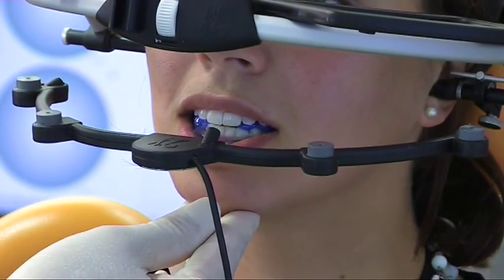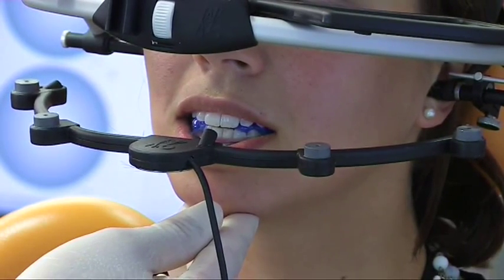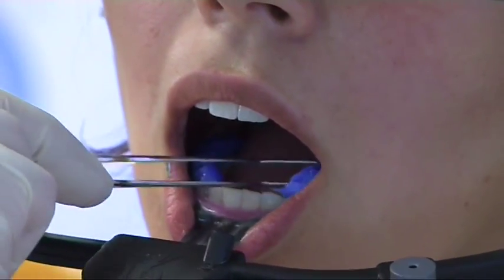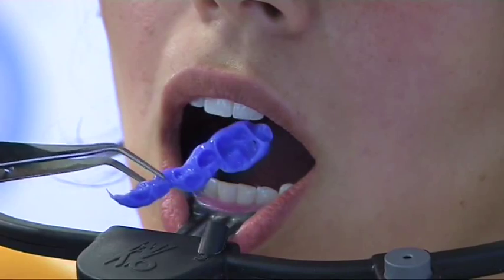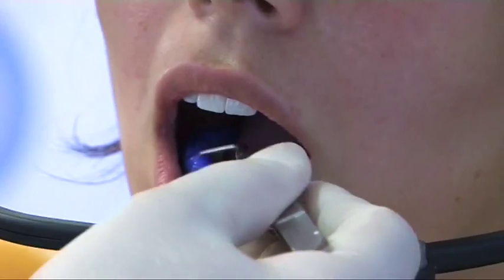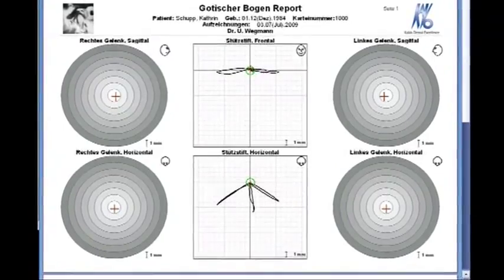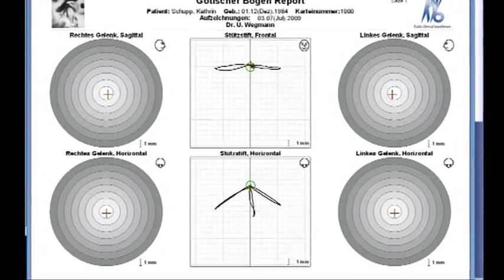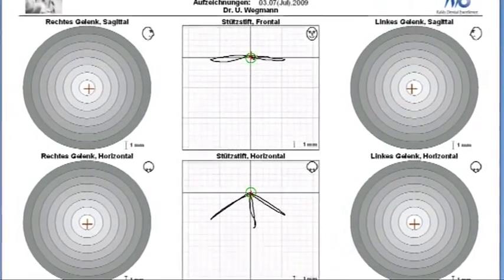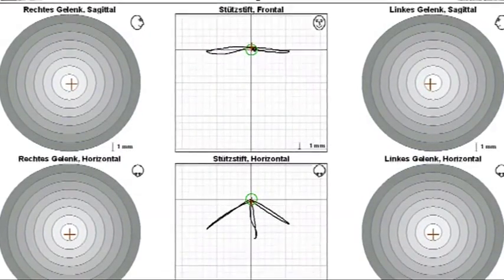Please remain in this position and don't move the lower jaw for the next one and a half minutes. After the registration material is hardened the patient can open the mouth and the registrations are removed. The recordings of the Gothic arch and last recorded positions are stored for documentary purposes. With the help of this registration the lower jaw model can be articulated exactly into the correct position.